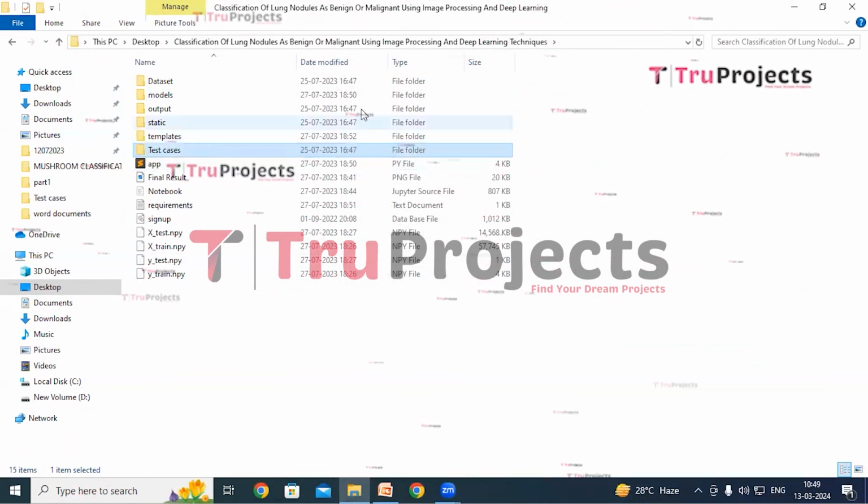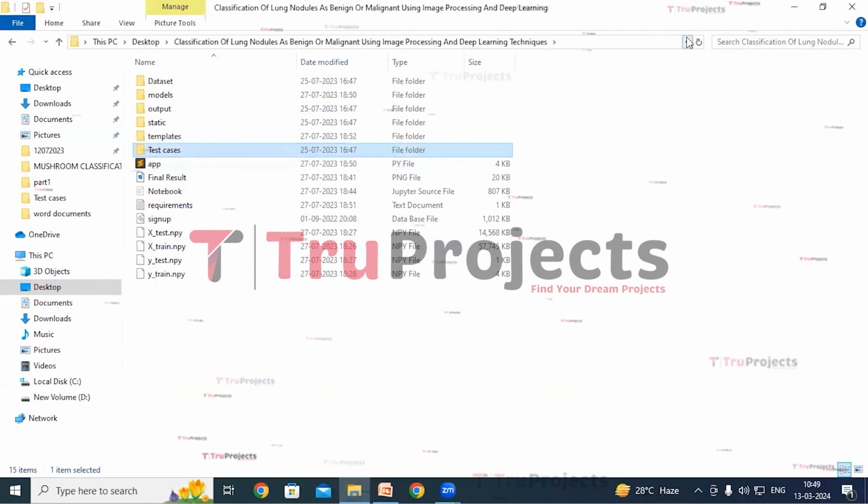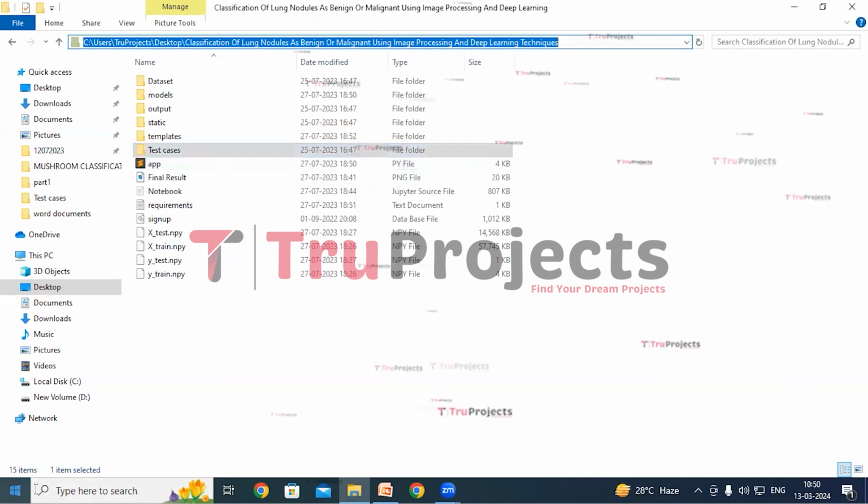So now copy the path of the code folder from the address bar of the file Explorer. I'm copying it. Open Anaconda prompt.